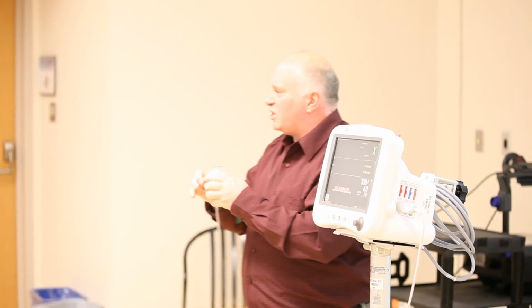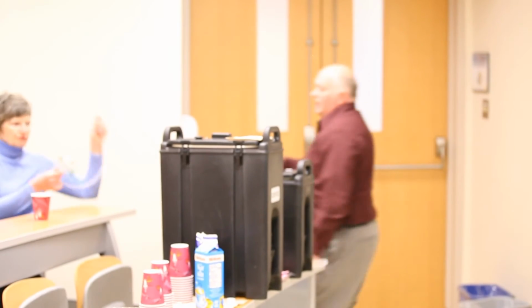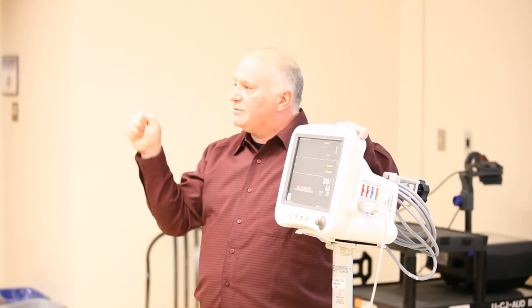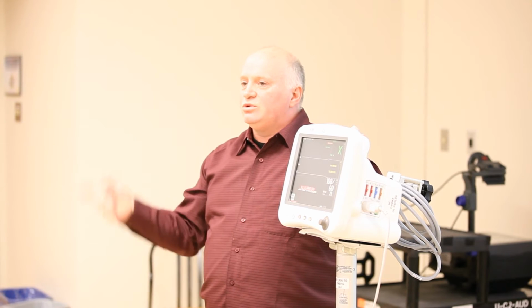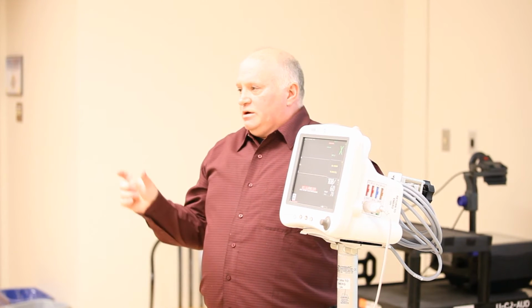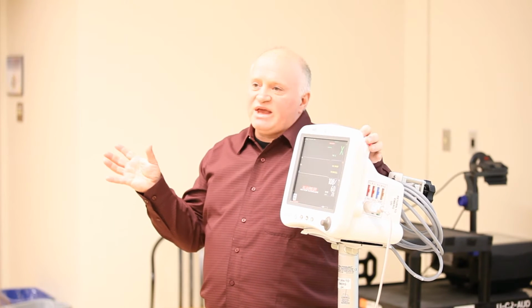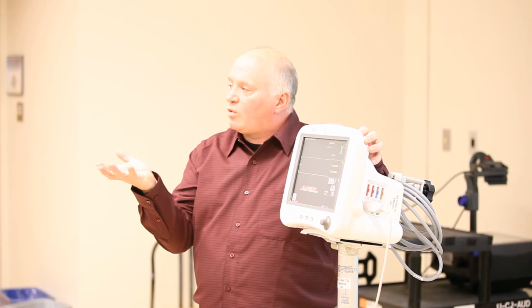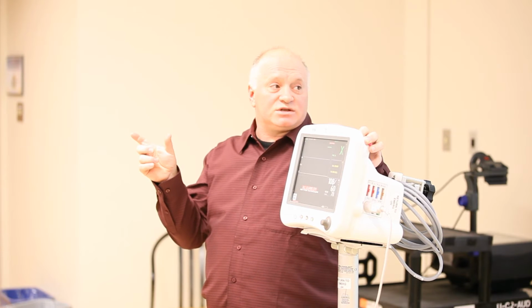Take this number with a bit of a grain of salt, simply because there's oxygen that's flushing through it. It's pressure fed. So if I could cut this off a bit, I'll pass this around for people to look at. You'll have to imagine that that portion of the catheter is cut off and it's just friction fit in there. Realize that that CO2 number may actually be falsely low because it's being washed with oxygen all the time. But again, we don't really know what their lungs are going to be like, so the number we get for end-tidal CO2 will be a starting point for how well they're actually ventilating and how much volume they're moving. Does that make sense? Is this the things that you want?